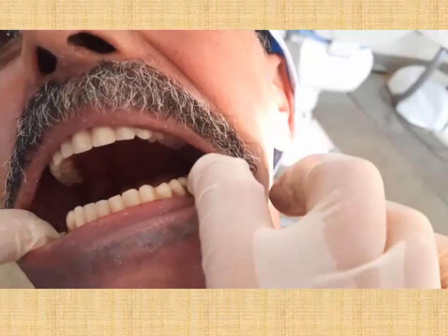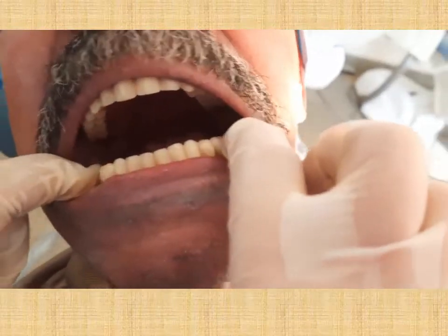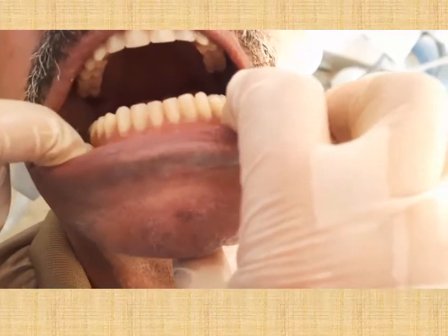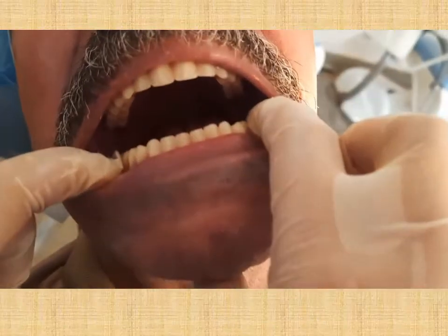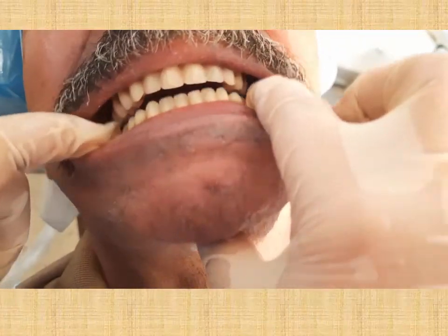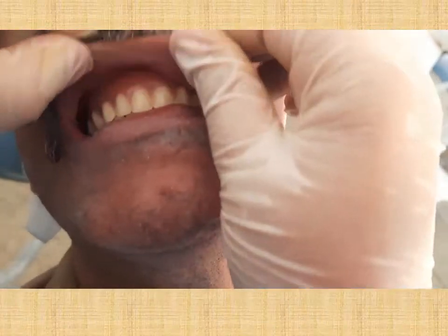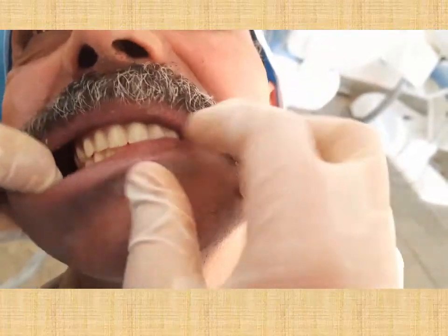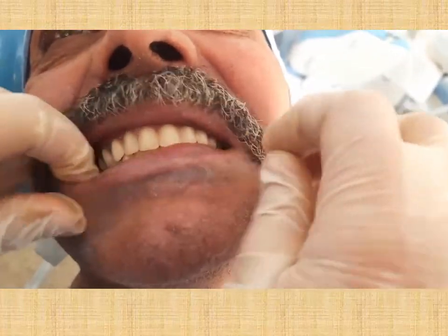After finishing and polishing the denture, insert it in the patient's mouth and check if there are any issues or problems the patient notices.